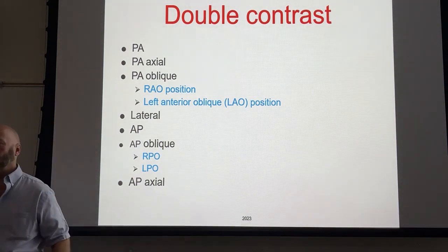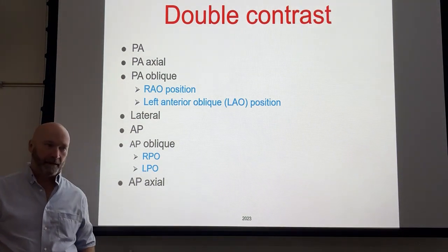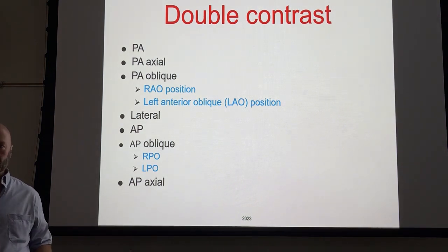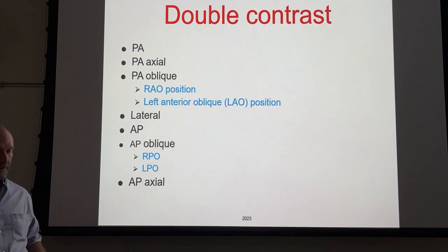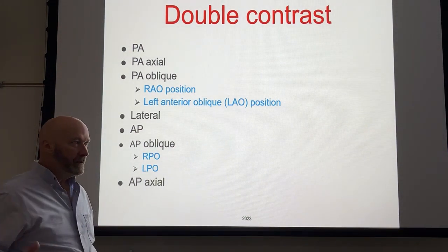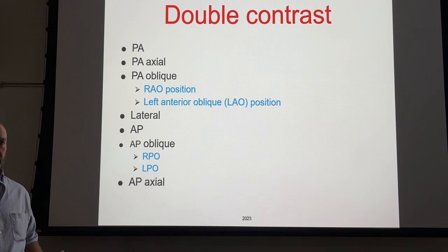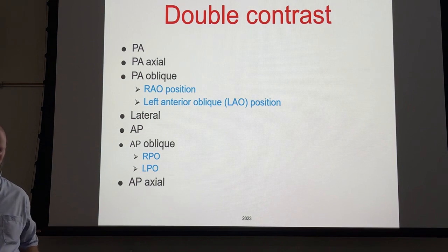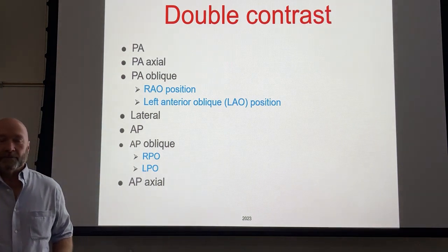So with double contrast, what that often will call for is the radiologist or the PA will fill the patient up under fluoro, maybe take some overheads, and then take the enema bag and put it below the tabletop level and open the valve back up and let it flow back into the enema bag. All right? So you're not going to completely evacuate the patient's bowels by doing that. The coating on the bowel is going to remain, and then they'll inflate the colon with air after that to separate everything out so that we can see the mucosal lining.